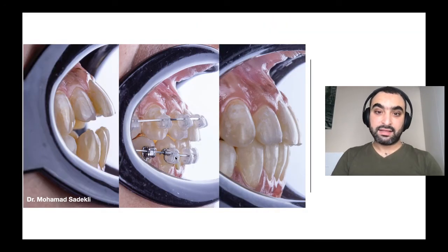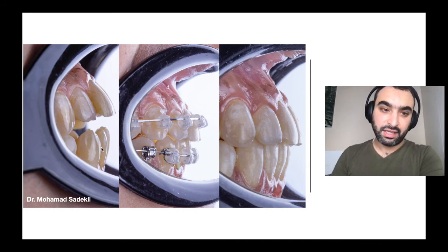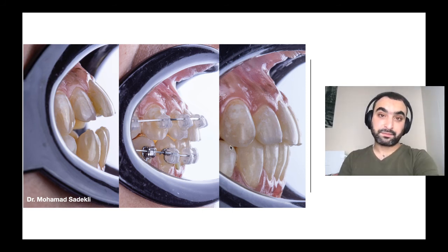And now you can see exactly what happened. See, the lower teeth actually were not that protruded, but the IPR here solved the crowding, okay? But here there was really good fixing for the upper teeth. See the axis. Now I have a good result.